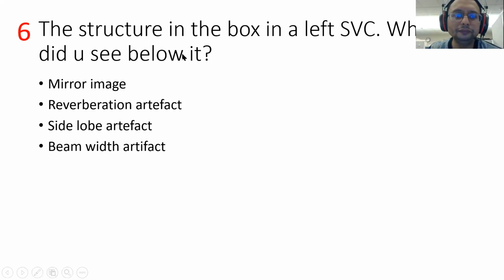So for example, our next person will be Saravanan. If let's say you see Saravanan here, and then suddenly you see a Saravanan at the side here. There is no reflector between the two Saravanan. It's not like there is a reflector, and that Saravanan himself does not become a reflector for himself. It's just like two Saravanan out of nowhere. So this is what we call a side lobe artifact.